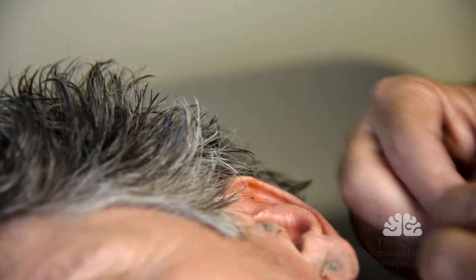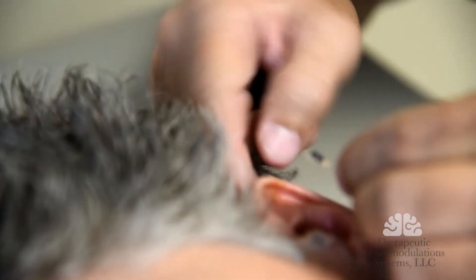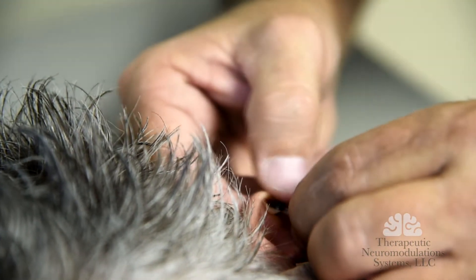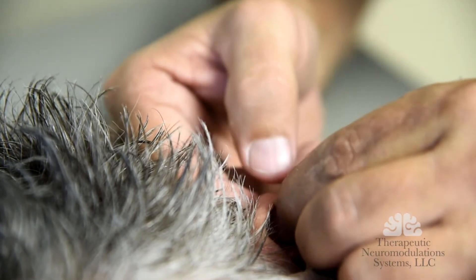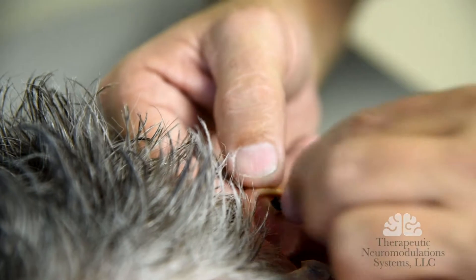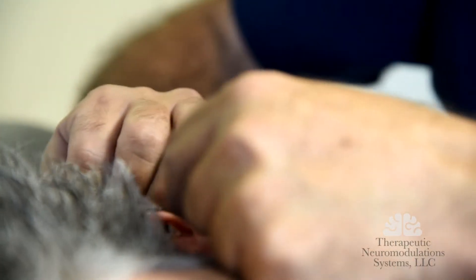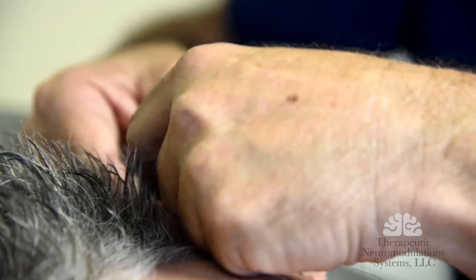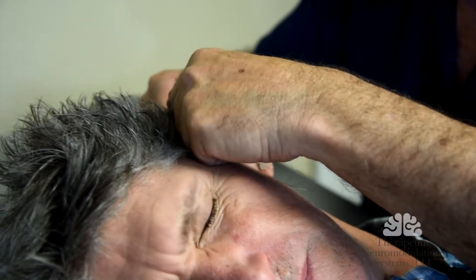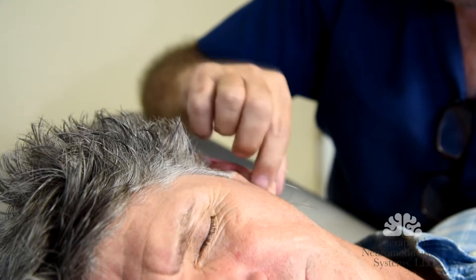This is always a little bit tougher one to install because it's the one that's harder to get to. So we're going to put it right there. Feel a little pinch — you ready? All right, that one's holding. You feel it working? Mm-hmm. Let's mark the time — time is 1:30. That's it, they're all in.